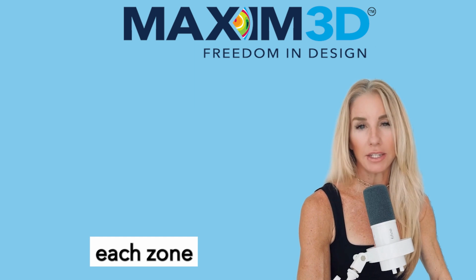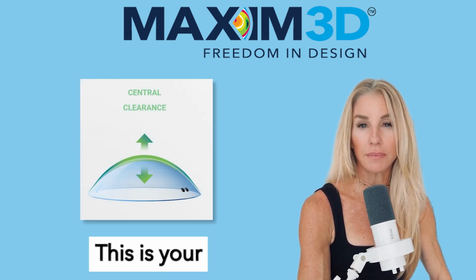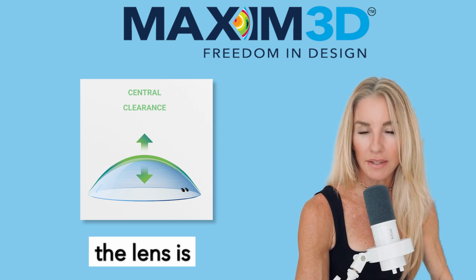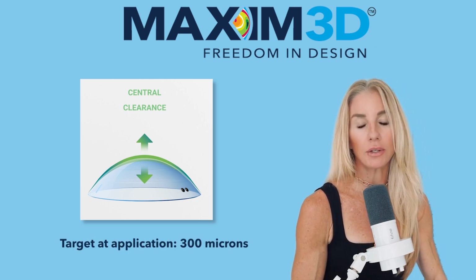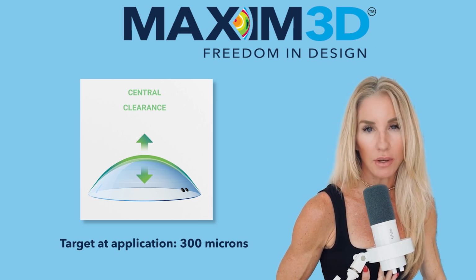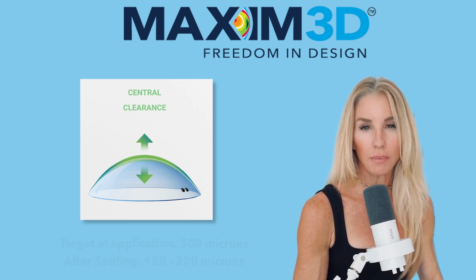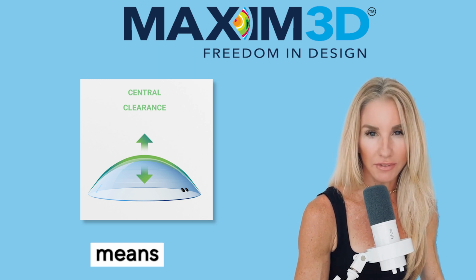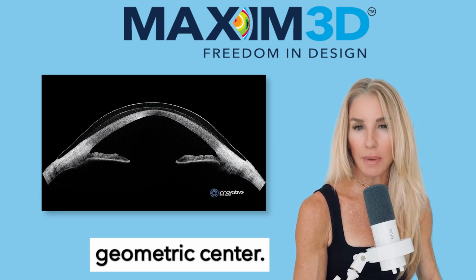Now let's assess each zone individually. Number 1, central clearance. This is your primary read once the lens is applied. This is our recommended target. At application, we suggest approximately 300 microns. After settling, 150 to 200 microns. But remember, central clearance means measuring over the highest sagittal elevation, not just the geometric center.